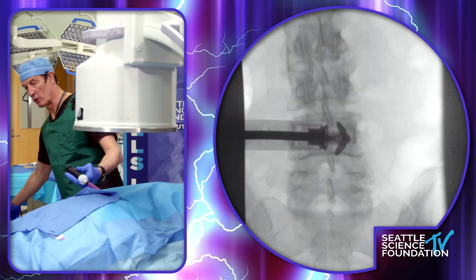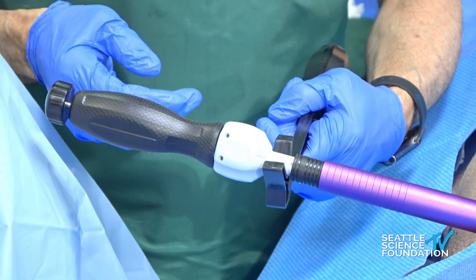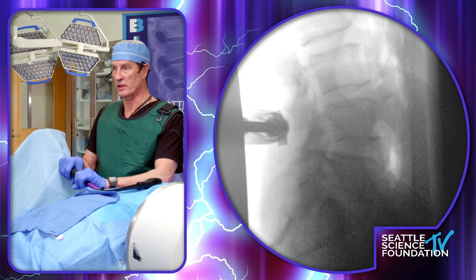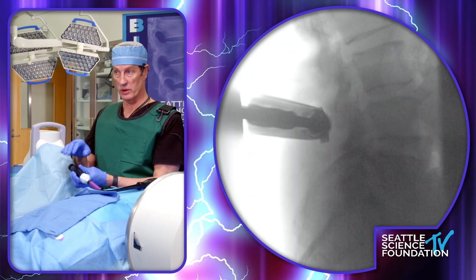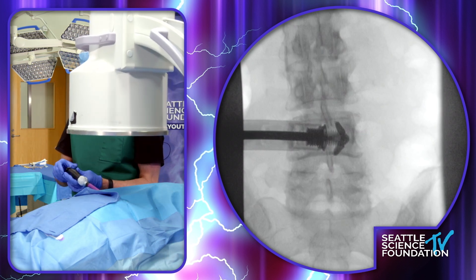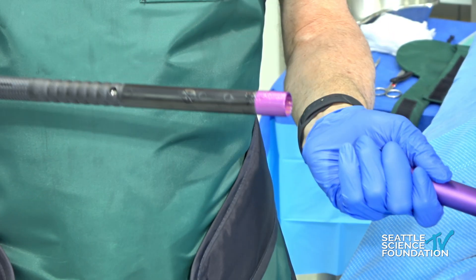So with that, let's take a look lateral. They have a plastic holder that we can hold the inserter with to keep your hands out of the radiation. I'm not going to really make any adjustments before I complete the three finger tight — I think that's pretty good. Come back around, take an AP. With this, I'm going to release the implant — I'm going to assume it was just like last time we took a look at it three seconds ago. I'm going to release the implant. This whole thing comes out — the dilator comes out.